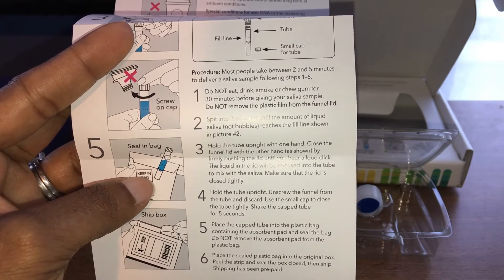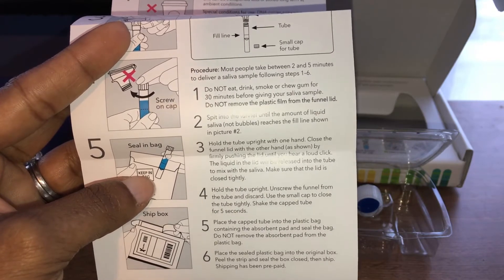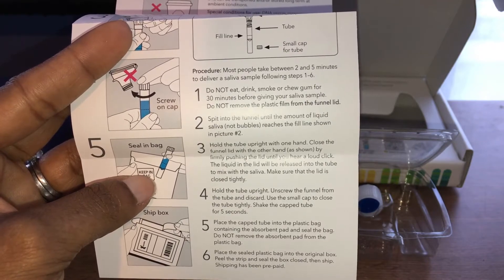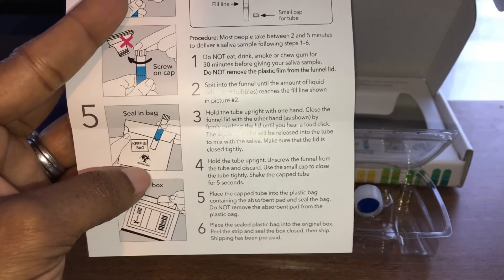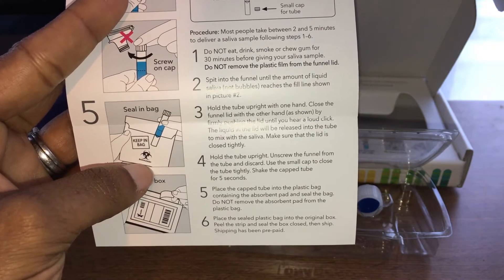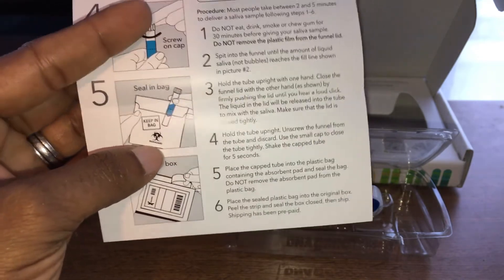Hold the tube upright with one hand and close the funnel lid with the other by firmly pressing until you hear a loud click. The liquid in the lid will be released into the tube to mix with the saliva. Make sure the lid is closed tightly, then unscrew the funnel from the tube and discard it. Use the small cap to close the tube tightly and shake it for five seconds.